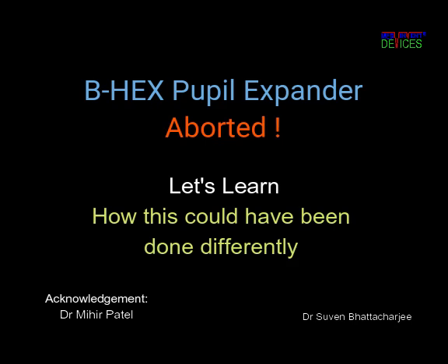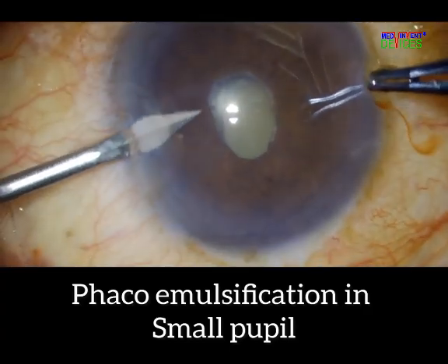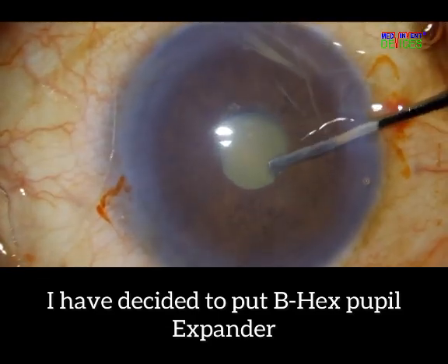A colleague sent me this video of an aborted attempt to use the B-Hex pupil expander. Let's learn how we could have successfully deployed the B-Hex in the same surgery. It is evident that the surgeon is otherwise very skilled, and I gratefully acknowledge his magnanimity in allowing us to learn from his mistakes.